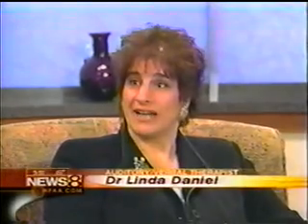Of course. Tell us about this cochlear implant. What does it do? Well, the cochlear implant is specifically for people with severe to profound nerve deafness. And it electrically stimulates the damaged nerve so that the brain can actually hear. Yeah. And that's what Amanda has.